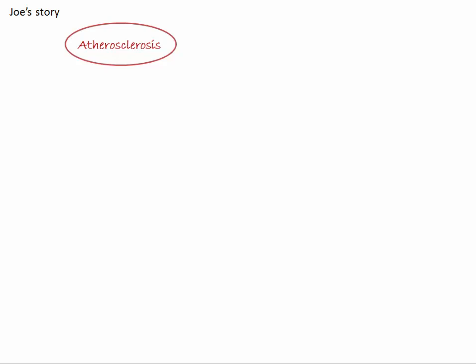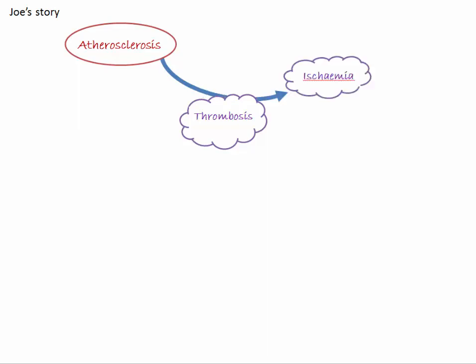You remember we saw a medium-sized coronary artery with eccentric intimal thickening. And we also saw that the atherosclerotic plaque in that coronary artery had been complicated by the process of thrombosis. You remember thrombosis is coagulation occurring in a vessel during life.